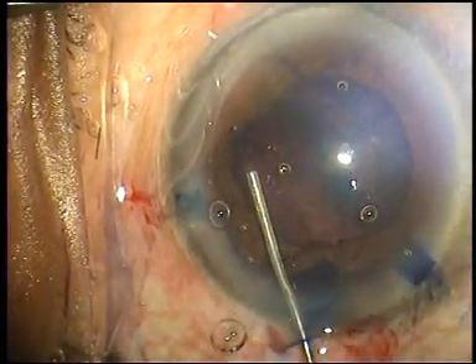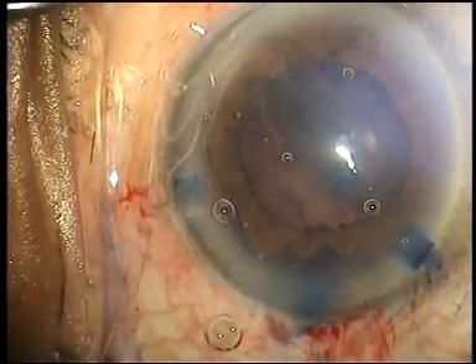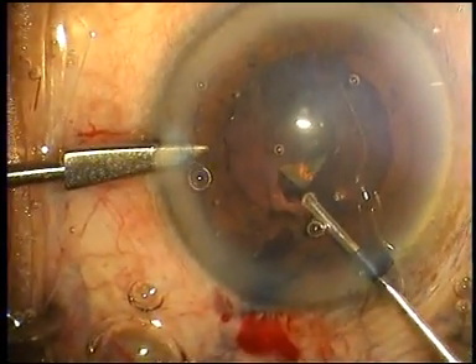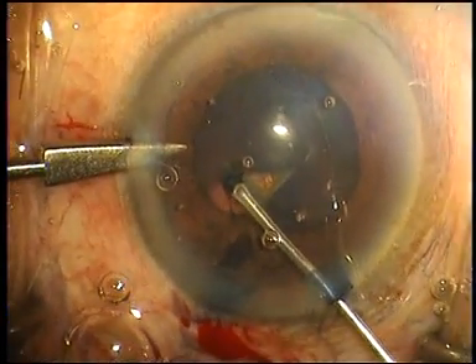After which the eye is filled with a viscoelastic — my preference in these cases is Viscoat — and the pupil, as you can see, is now of a more manageable size. The eye is stabilized with the left hand using the Banaji eye lock.